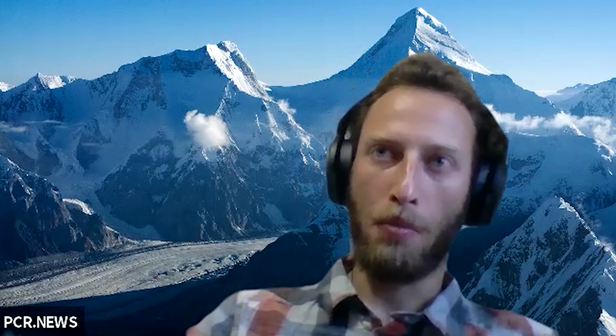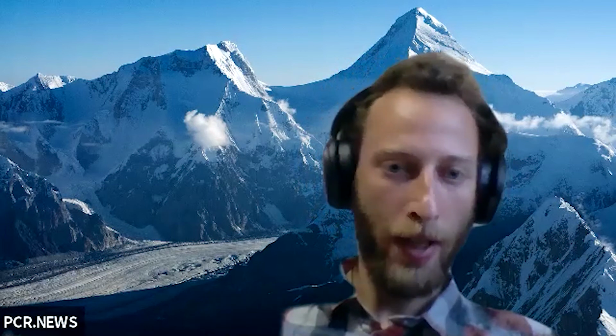Actually, I wonder, in NIPT, I do understand how you can measure the copy number variation because basically it's a stable copy number variation. In cancer, I suppose you measure basically copy number per SNP. And you have different minor allele frequencies, and it becomes increasingly difficult. How do you cope with this?